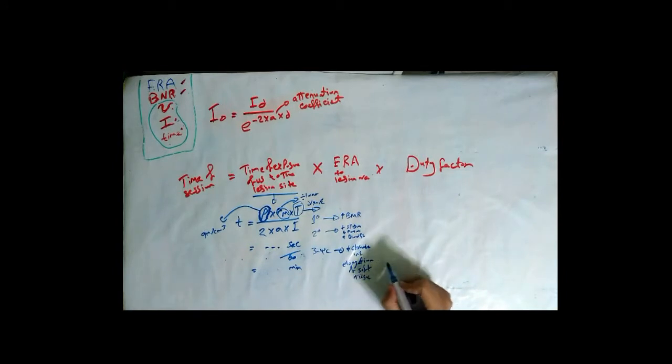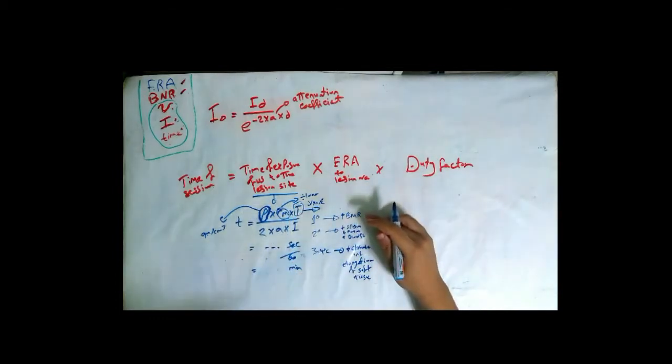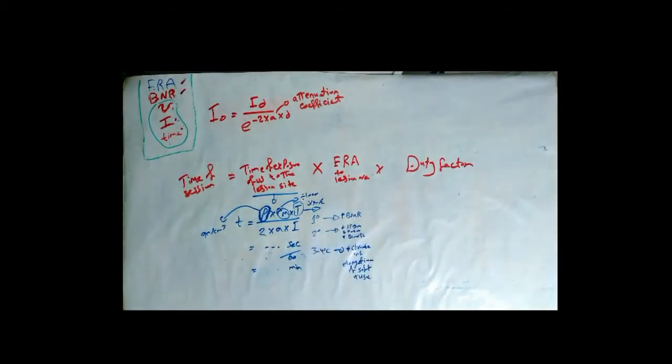So according to the therapeutic effect that you need from ultrasound, you will substitute in T, the temperature. You need to elevate the tissue by 1 or 2 or 3 to 4. If you need a non-thermal effect, you can substitute by 0.5. A here stands for the absorption coefficient.